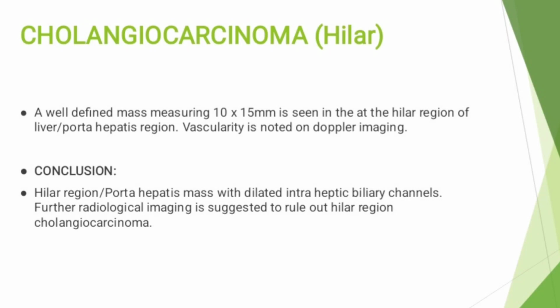It is very vital to mention the diagnosis. It's very important. Whatever you think, your knowledge should be updated, and you must know that these are the differentials and this is the clear-cut diagnosis. If in case of any doubt, you must mention that further radiological imaging is suggested to rule out whatever you have in your mind, and mention it on your report to help your colleague, surgeon, or medical professionals.